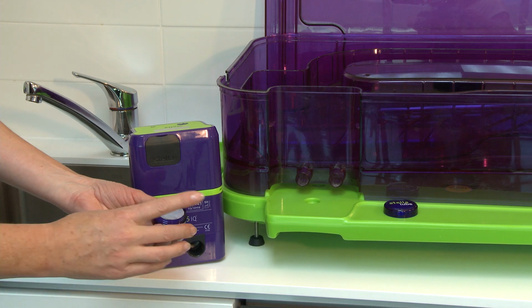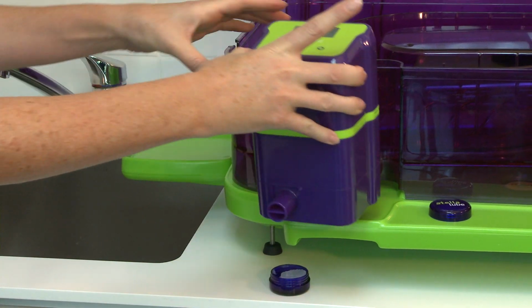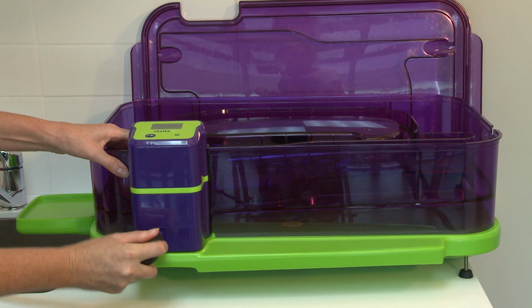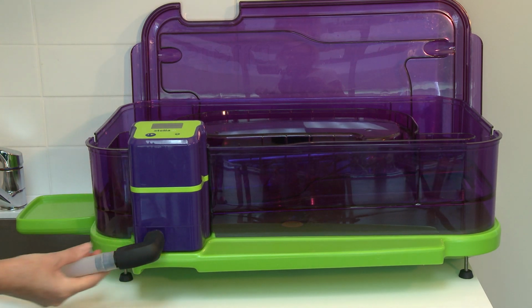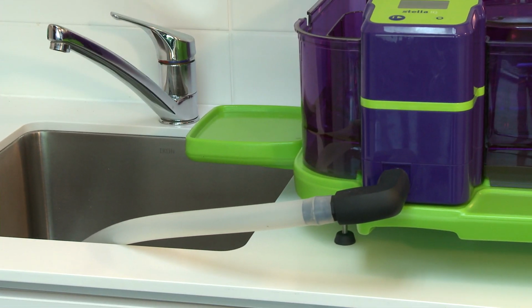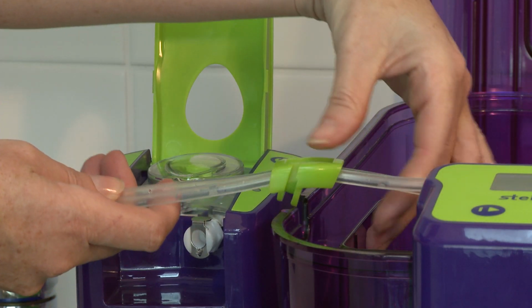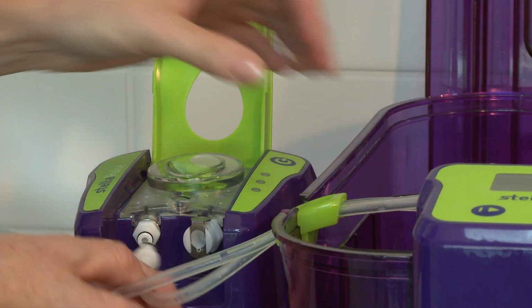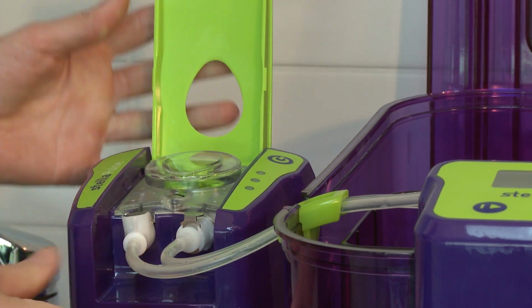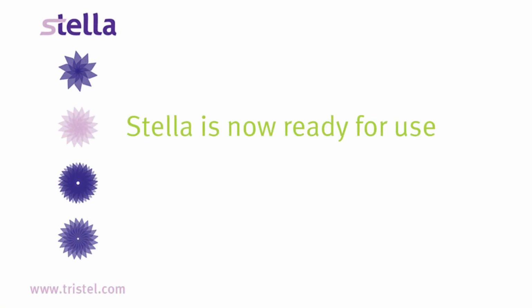Apply Stella Lube to the IQ outlets before first use, then every 6 months. Firmly attach Stella IQ to the base. Connect the drainage hose set to Stella IQ and direct the end of the tube into a sink or waste container. The drainage hose must flow and not be immersed in fluid or it will block. Place Pulse on the cradle shelf. Place the tube mount on the tray cutout so the pickup filter is placed in the inner compartment. Connect the tube set to the Pulse. Stella is now ready for use.